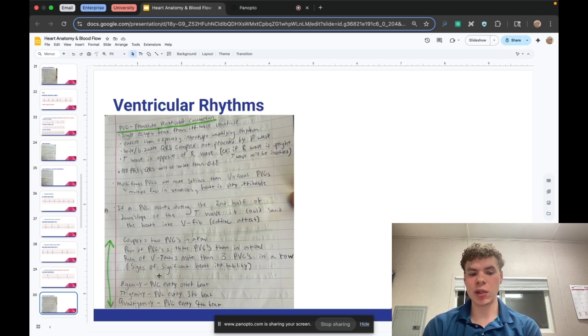And bigeminy is a PVC every other beat. Trigeminy is a PVC every third beat. And then quadgeminy is a PVC every fourth beat.